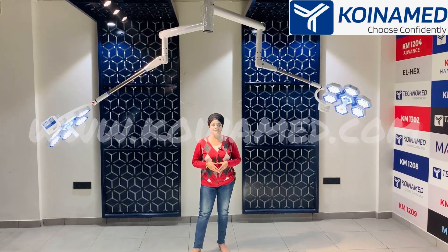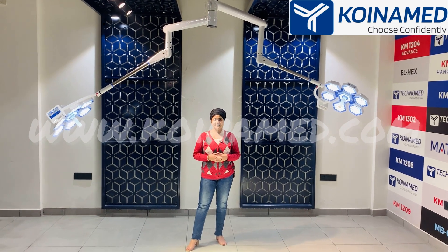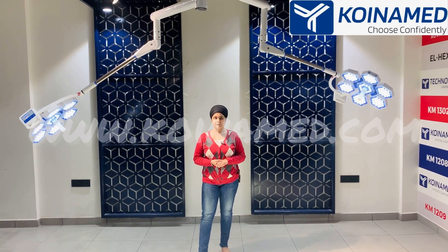When you combine both domes, you get 3,20,000 lux in total, which means 1,60,000 lux from each dome. This is the standard model of double dome operation light that we provide to our clients.